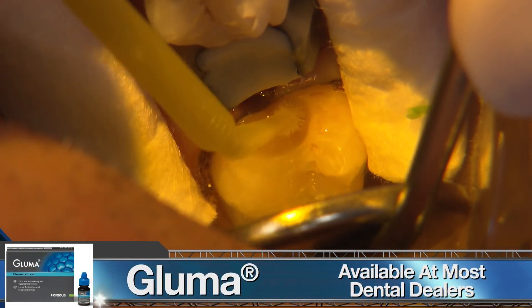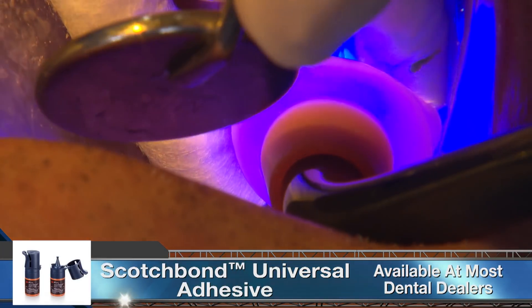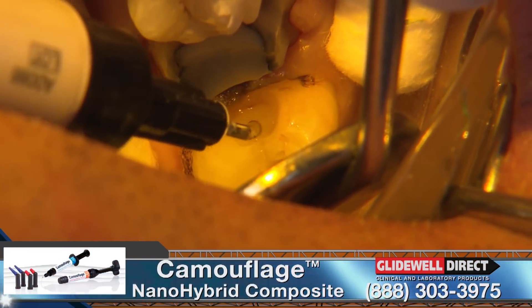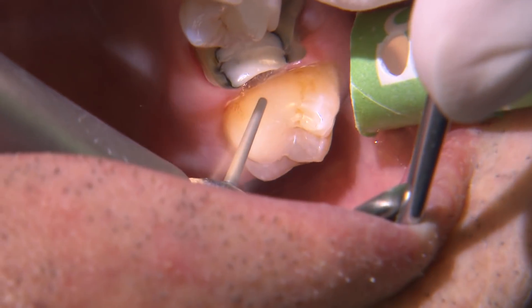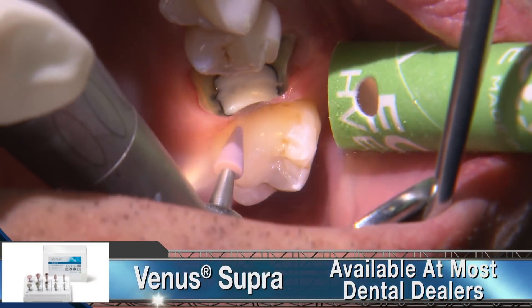This is followed by a one-minute application of Gluma desensitizer. After a minute, I'll use a surgical suction to aspirate any excess. Then I'll scrub Scotch Bond Universal into the prep for about 20 seconds. I incrementally restore the cavity using camouflage nano-hybrid flowable composite. I use a fine grit diamond burr for the gross finishing and contouring, then polish to a smooth finish with the Venus Supra Polishing Kit.